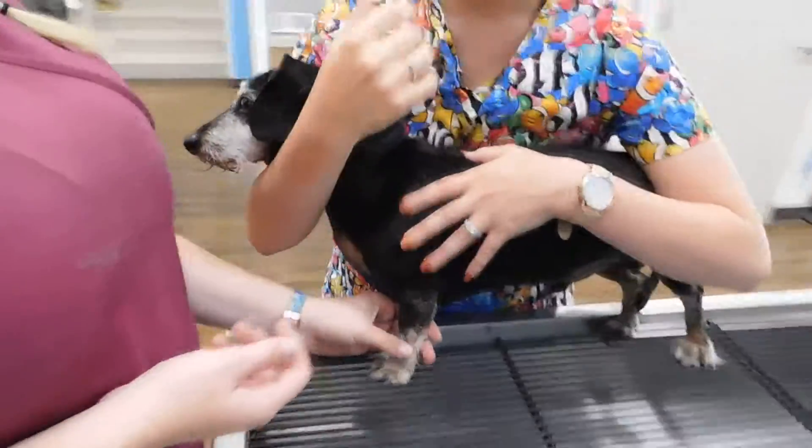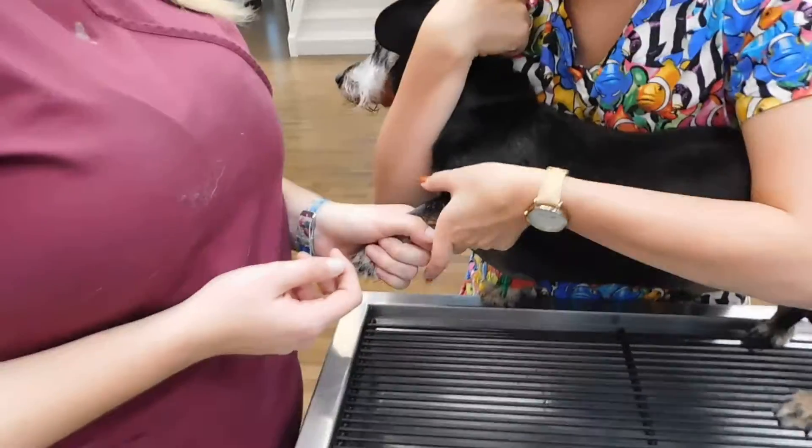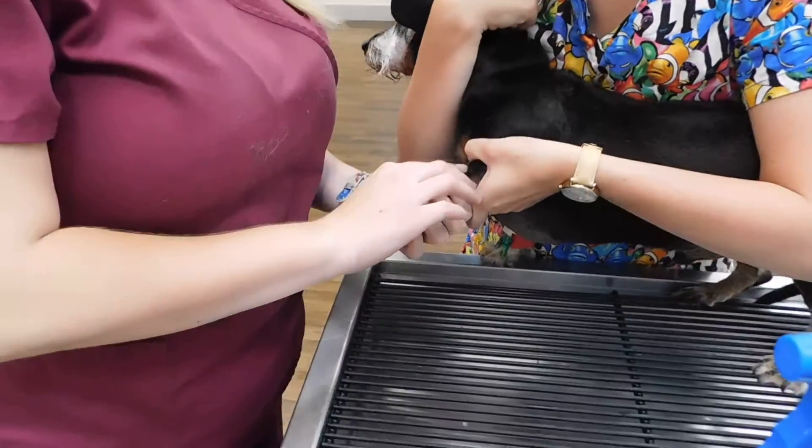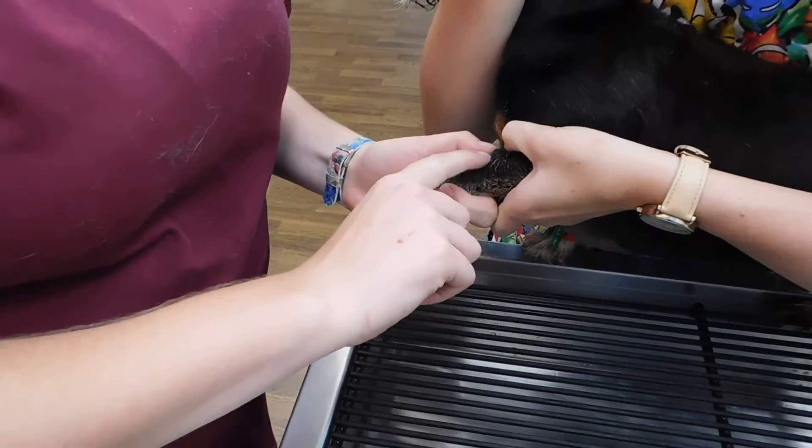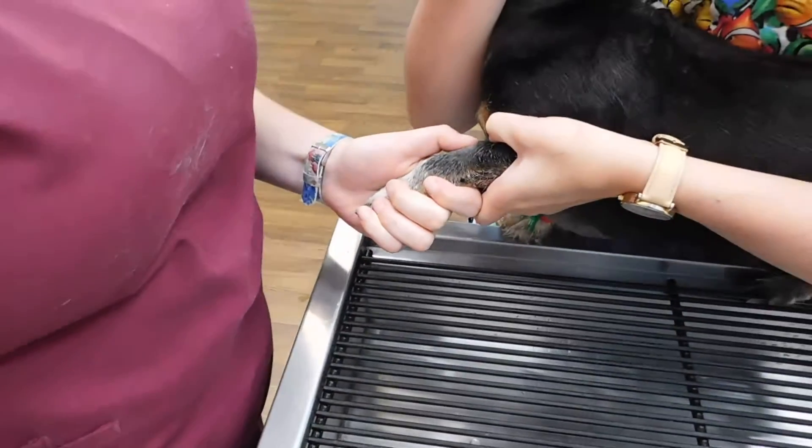The assistant is going to go ahead and restrain the patient and hold off the cephalic vein. I'm going to palpate and then prep the site with alcohol.